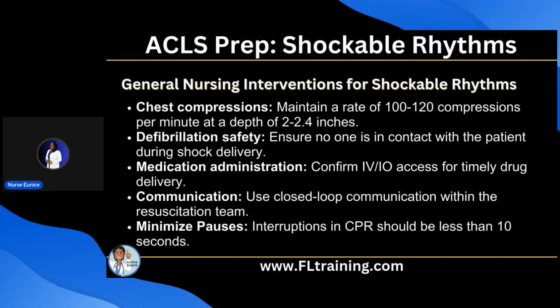Defibrillation safety: when I'm teaching you all in the classroom setting, a lot of you do not clear head to toe. You have to clear the bed. You have to make sure no one's touching. Otherwise, you're going to shock one of your coworkers. And we have to call another rapid response team in for them.